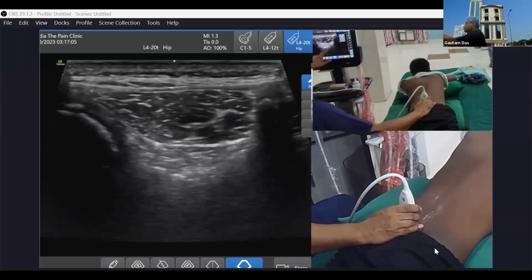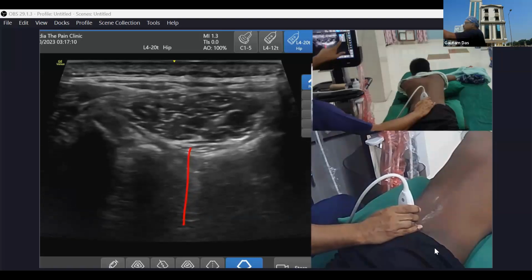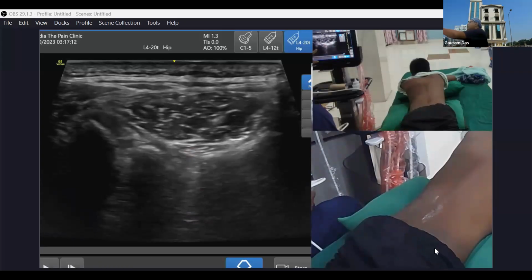Here the S2 foramen is not there. But now here you see the ultrasound is going down. S2 foramen is appearing. So now you can see there are two bony breaks. One bony break is here, where the ultrasound wave is going down. So this is the synovial part of the SI joint, you can come here. And another is your S2 foramen that is going down here.